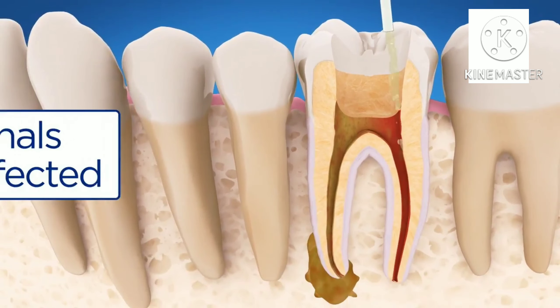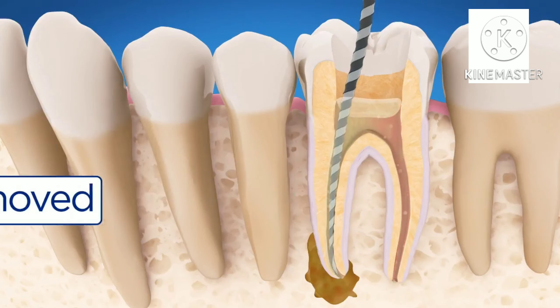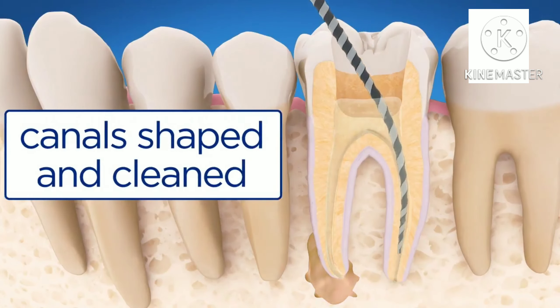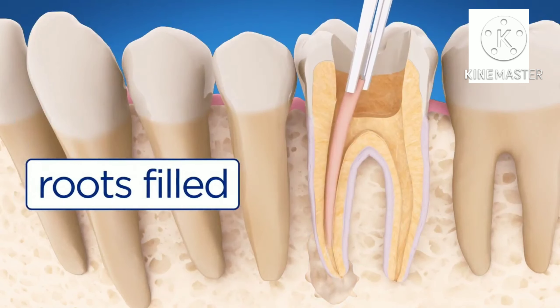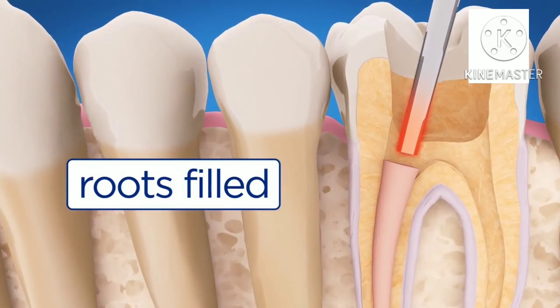Fluid is put in the canals to kill any bacteria and help rinse out debris. Then the pulp is removed. Using small instruments, the endodontist carefully cleans and shapes the canals. After the space is cleaned and shaped, the endodontist fills and seals the root canals.